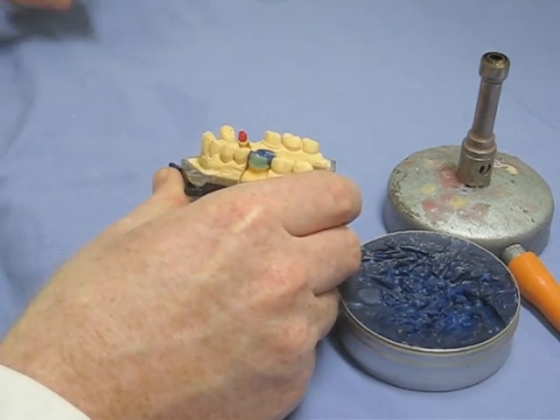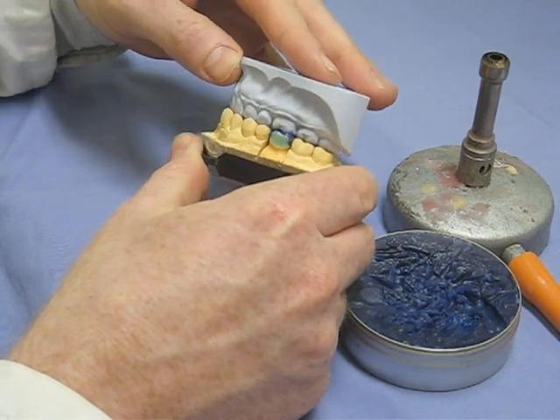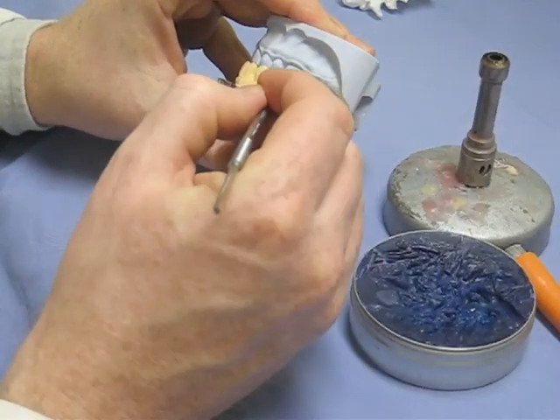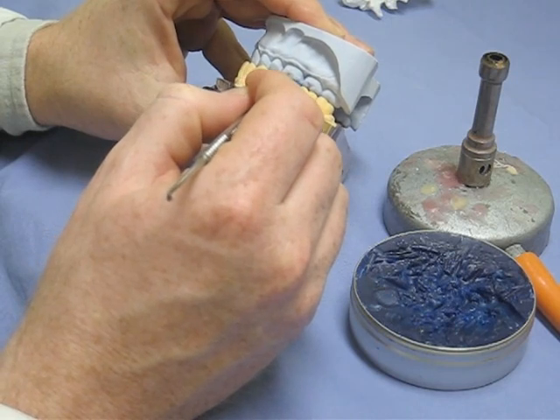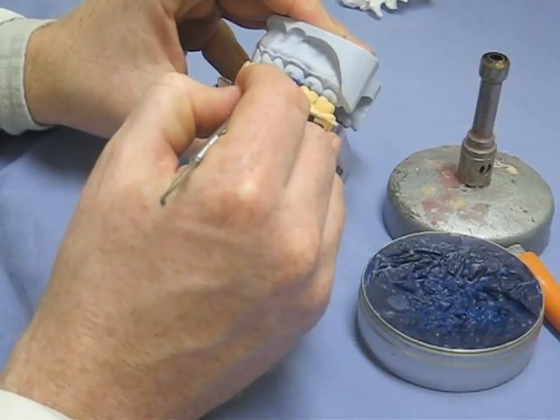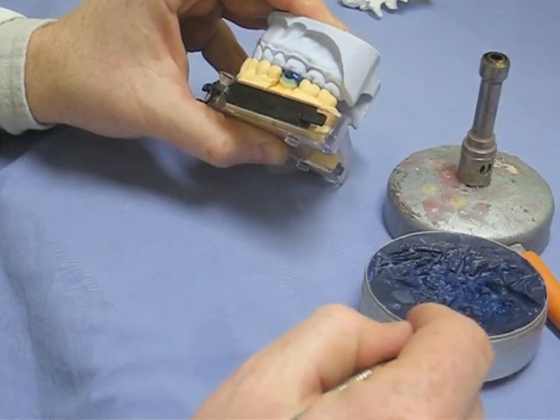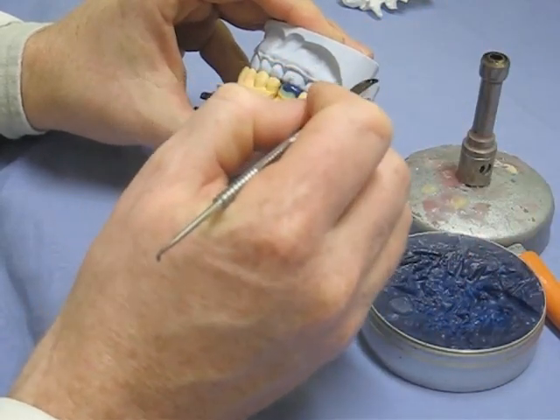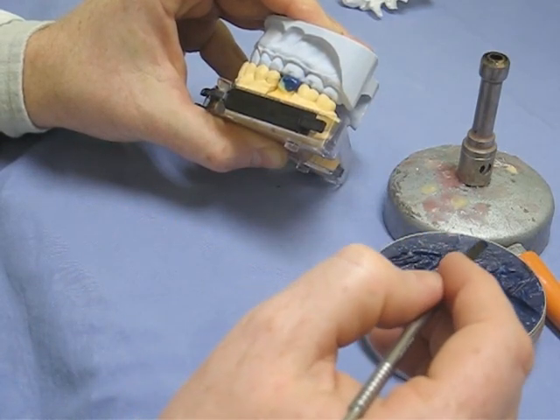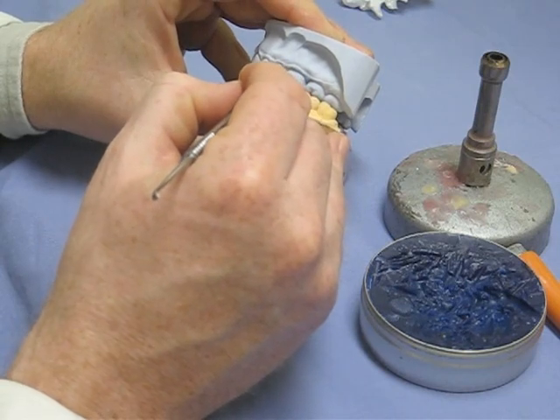Duncan here is doing a hybrid of a number of techniques. He's built up the cusps and is using the opposing model to form the contacts, giving the heart of the cusps and the depths of the fissures all at once. Once he's got the height of the cusps, he can then form the buccal aspects of the cusps, using a little bit more molten wax, trying to control it so it's not going all over the place and leaving the previously placed bits intact. Leaving plenty of time for the wax to cool so you don't disrupt anything already placed.